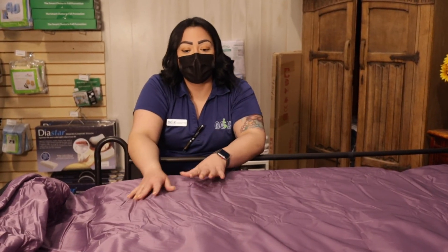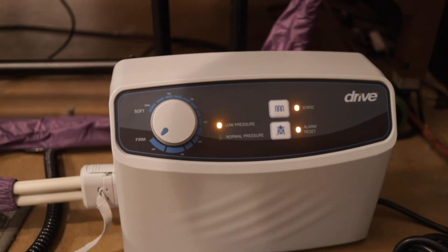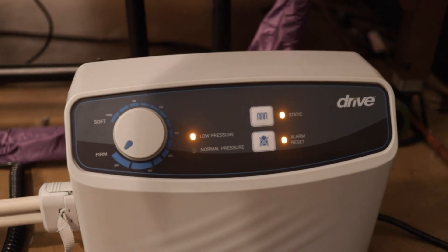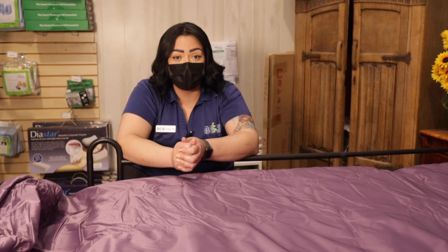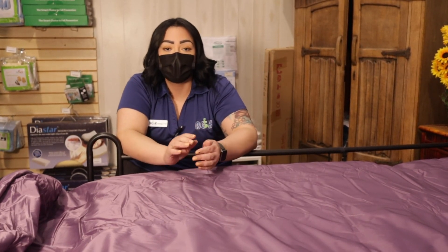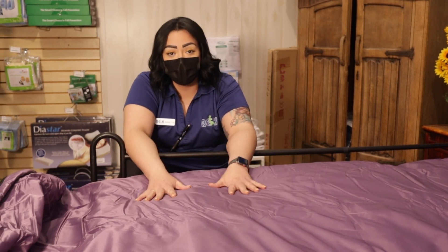This mattress comes with a pump, and the pump has an alarm. When the air mattress is getting to a really low pressure — depending on the person's weight — it's going to give you a little alarm letting you know the air is really low. Make sure you're able to crank it up a little bit more. The pump also allows you to set how much the client weighs to determine how soft or firm you need the mattress to be.